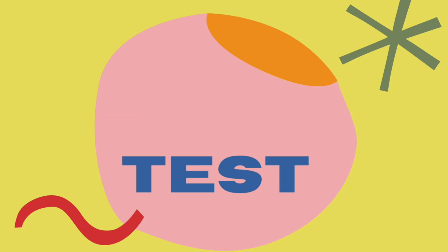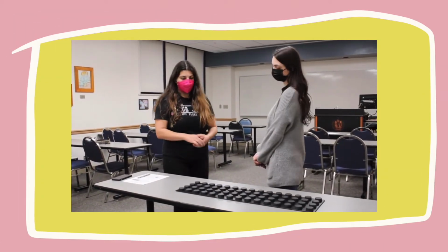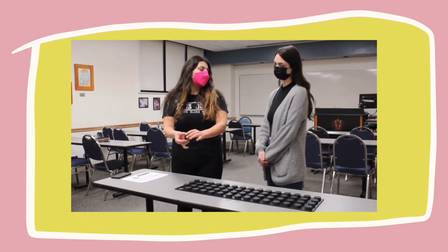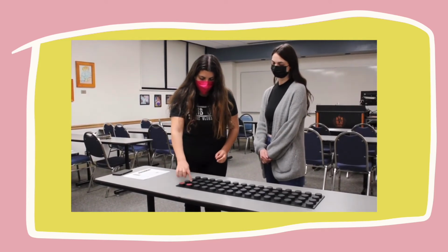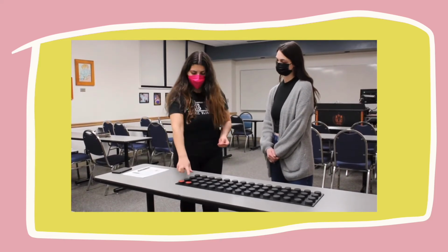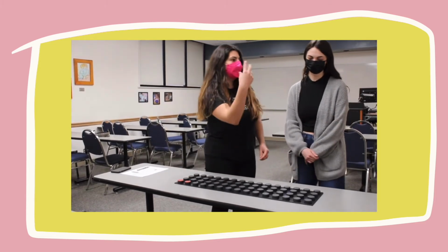Turning test. So we're going to be doing the turning part of the dexterity test. What I'm going to have you do with your left hand is pick up the block and give it to your right hand and then put it back on the opposite side. And you're going to keep doing that for the rest of the row. Make sure you place it exactly. If you accidentally drop it, you're going to have to pick it back up and put it back right side up.